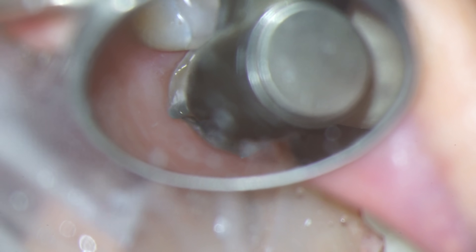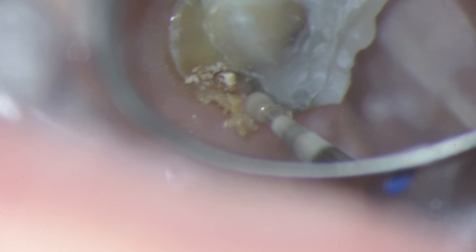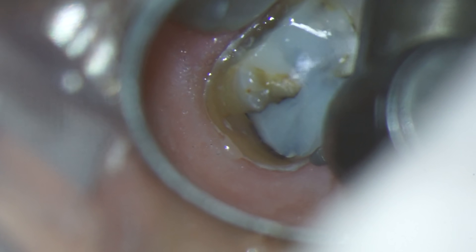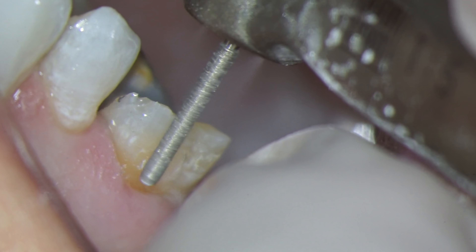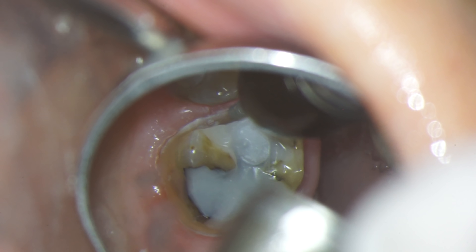As I'm trimming the tooth for the crown, sure enough there's another cavity. So I go ahead and remove that, and then we just build it back with a little bit of fluid composite material. I have to overbuild it and then trim it back to size. It's really important that this little mountain road I'm trimming around the tooth is really clear, because the laboratory technician is going to use that mark as the guide for where the tooth stops and where the crown begins.